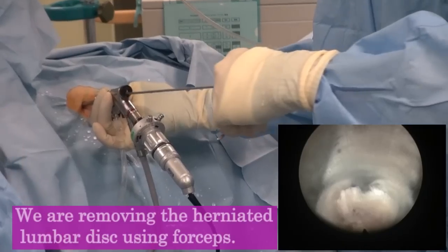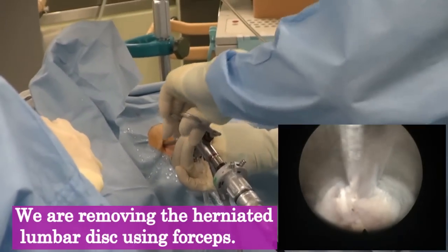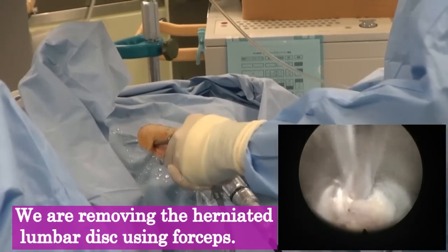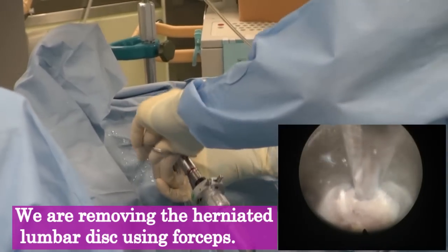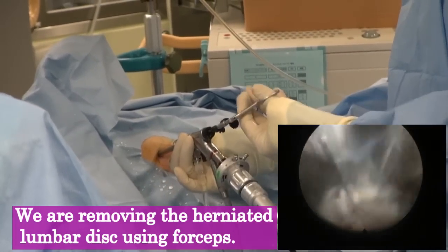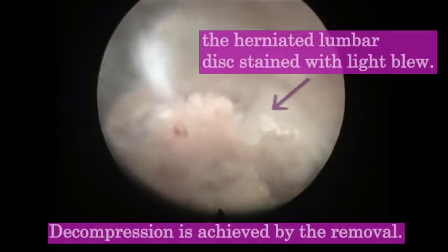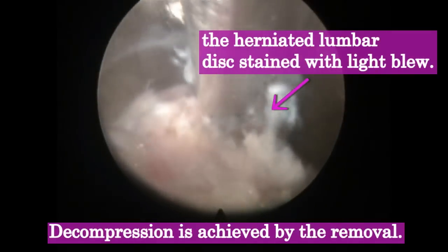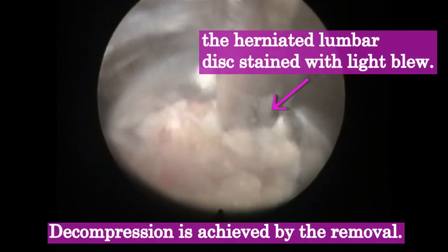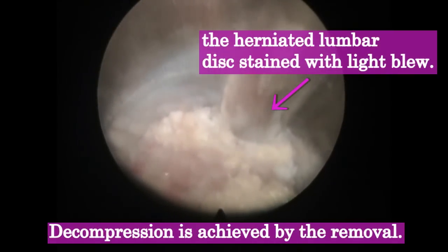The herniated lumbar disc is being removed via forceps specially designed for the endoscope. We can now see the herniated lumbar disc, which is stained light blue from the indigo carmine contrast medium.